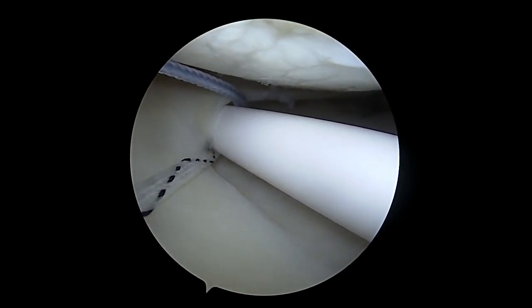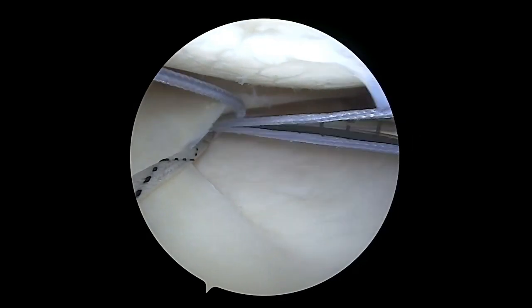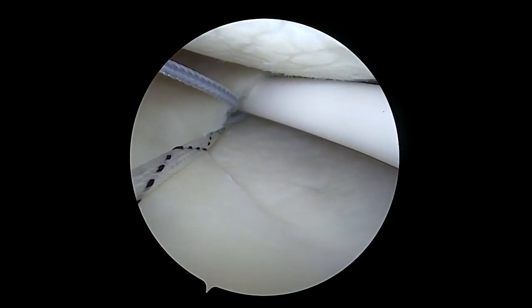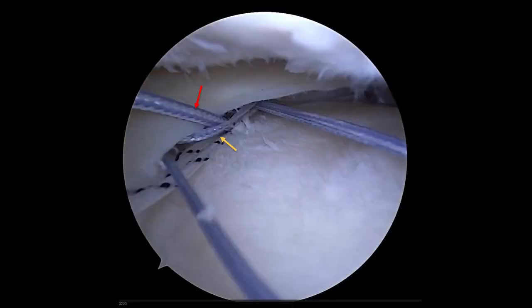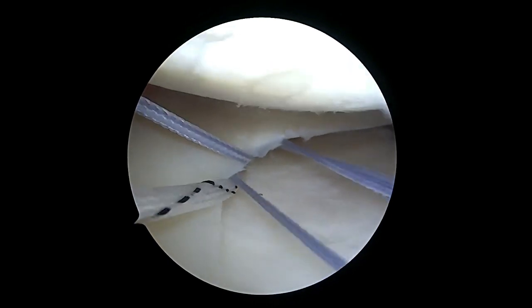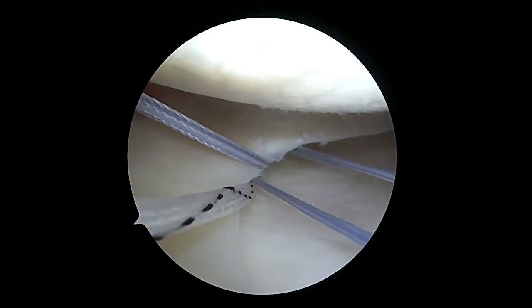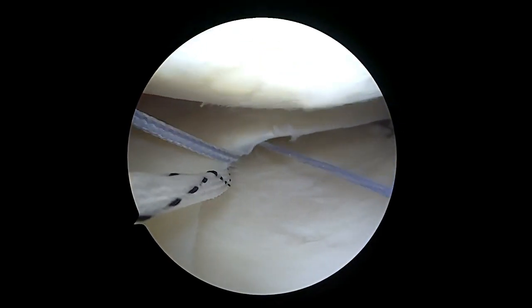The key here is to place the horizontal mattress on the undersurface of the meniscus through the joint capsule and remnant meniscotibial ligaments on either side of the blue repair stitch of the knotless anchor we just placed. Effectively, this staples the repair suture from the anchor to the meniscotibial ligament, creating a point of fixation without piercing the meniscus or meniscal capsule junction, as in previously described techniques.